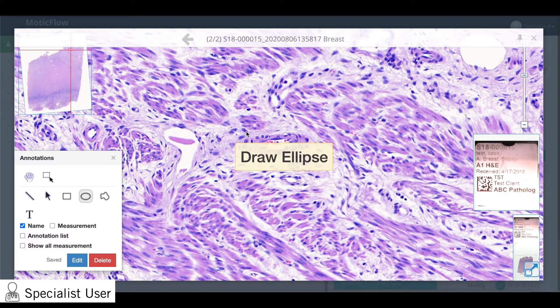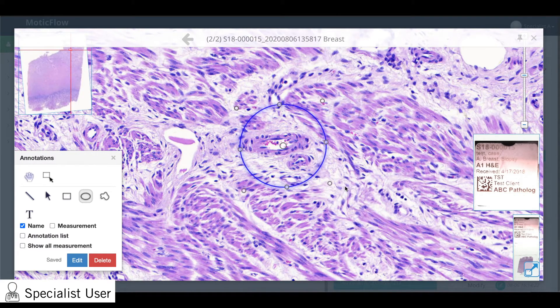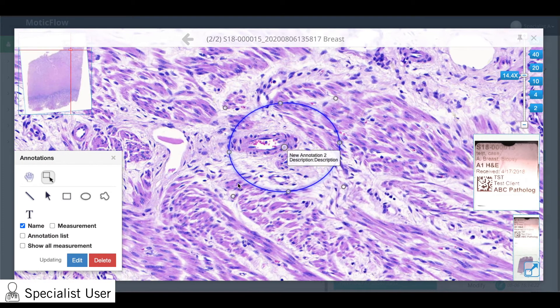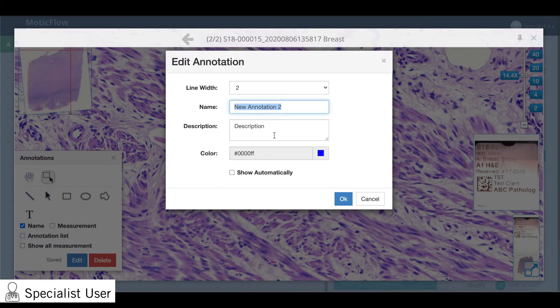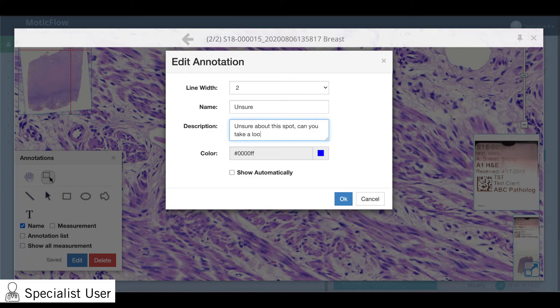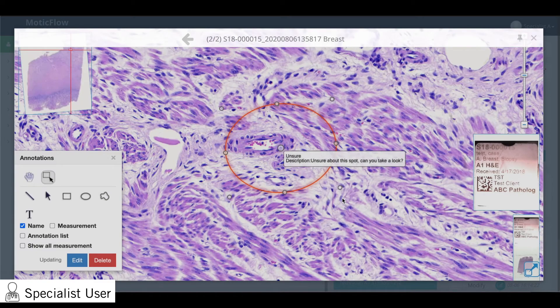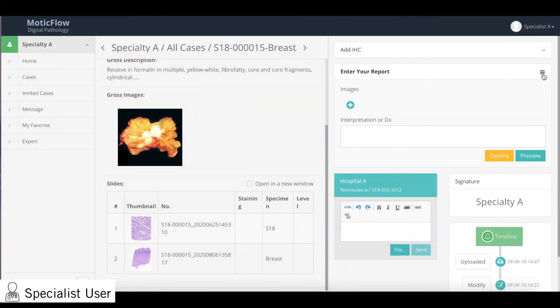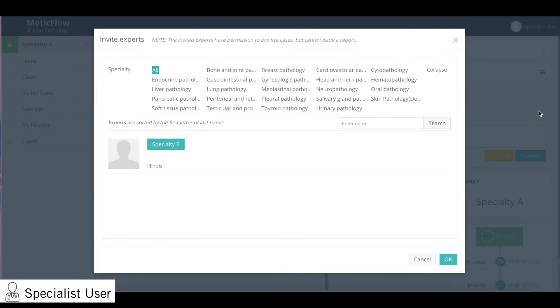You can mark the area and leave an annotation with any of these tools. You can also invite an expert for a second opinion or forward your case to another consultant.